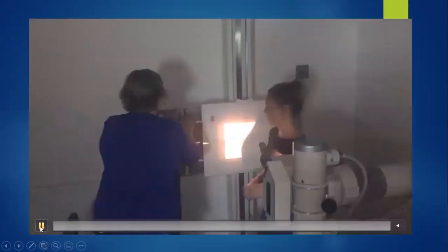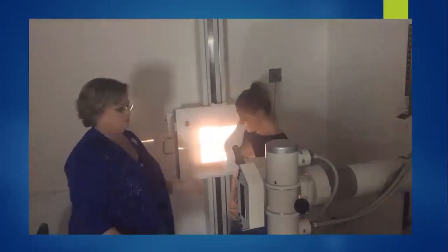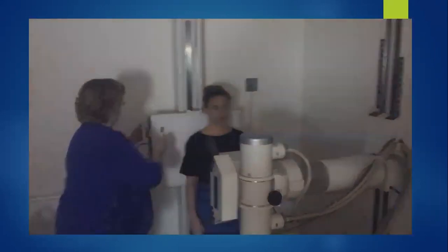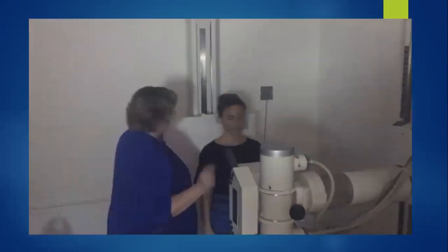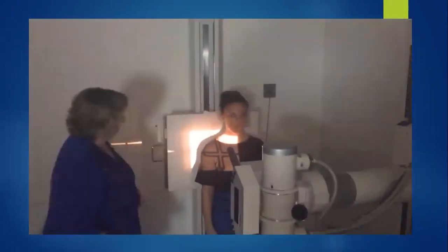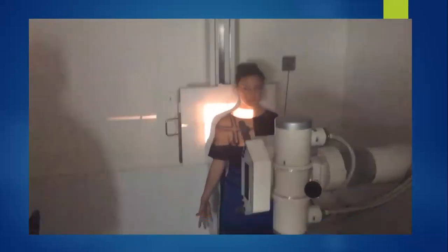So here's our video of the internal and external. She has it in crosswise, she's marked. Then you're going to just put your patient in there to center them, get the right height, that 1 inch inferior to coracoid process. Gives you about 2 inches above the shoulder top, so you can put your marker up there. Once you're marked, do not move it, and then position the hand externally till the epicondyles are parallel to the IR. That's our external rotation.